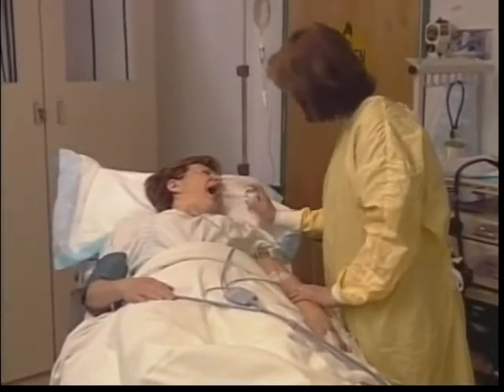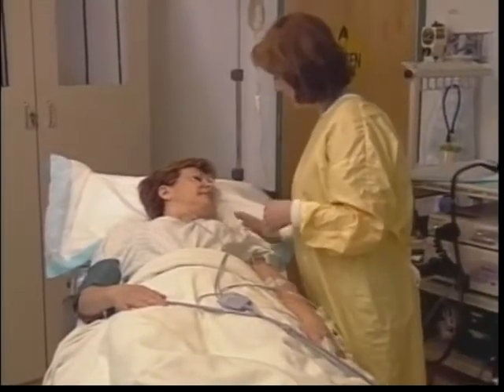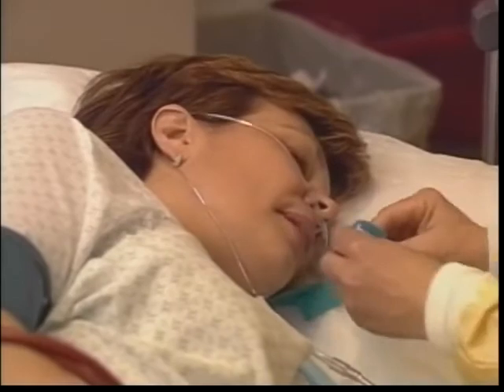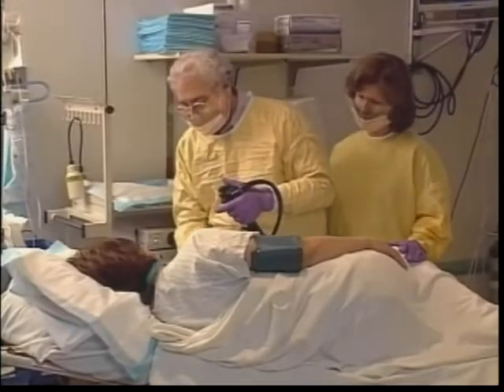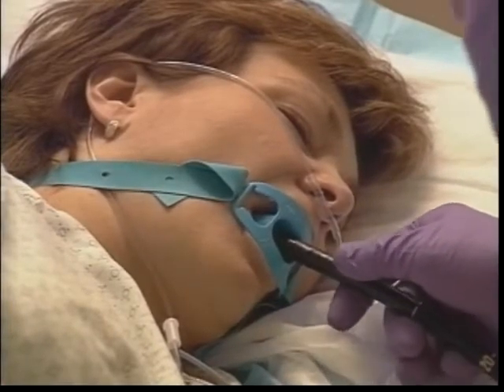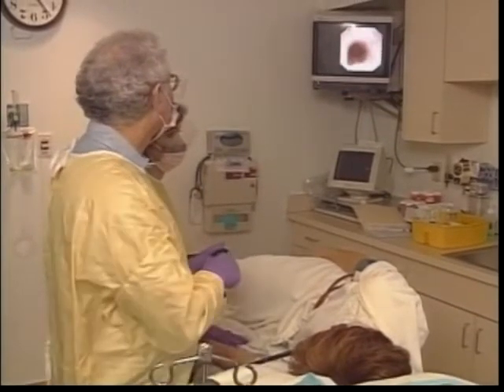You may be given medication to gargle or a numbing spray to numb your throat. The nurse will help you to lie on your left side. A plastic guard called a bite block will be placed in your mouth to keep it open and to prevent damage to your teeth or to the scope. You will be asked to swallow the endoscope when it is put in your mouth. The medications you have been given make swallowing the tube easy for almost all patients. Remember to take slow, deep breaths through your nose to help you relax. The scope will not get in the way of your breathing.